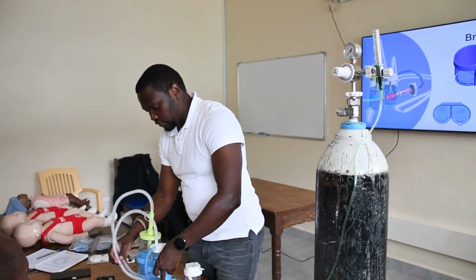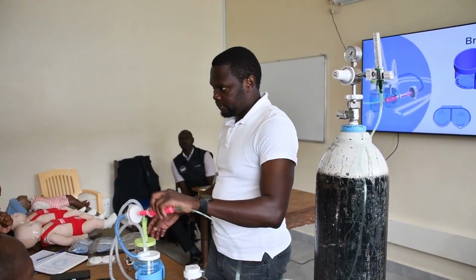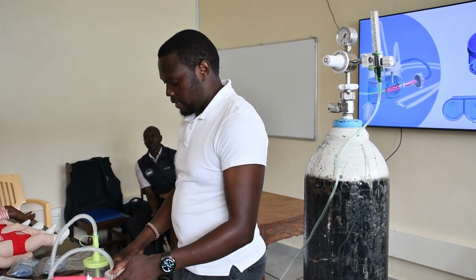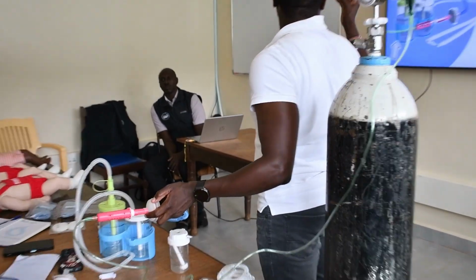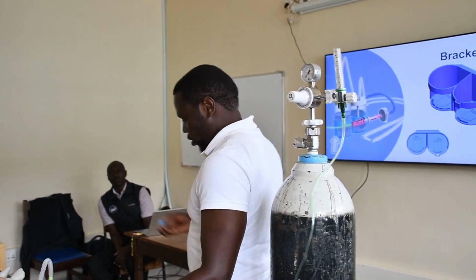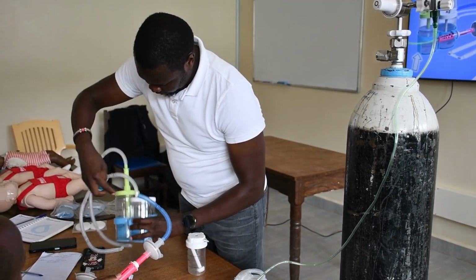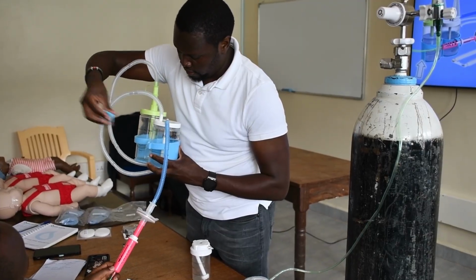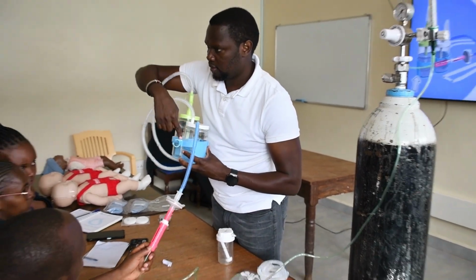The other thing that is floating and goes around is the blender. So you also want the blender to be there in the system, and to achieve that you have the blender clip. You see this part here on the side of the humidifier, so it comes and rests in there.